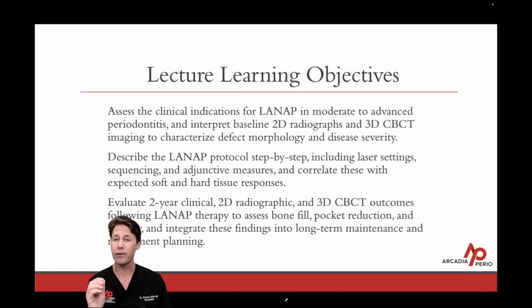And finally, this is a case that's been followed up for 2 years. This patient recently came in March of 2026 for a 2-year follow-up with periapical imaging and CBCT imaging. A really well-documented case that shows the power of regeneration with a laser-generated blood clot. I want you to be able to assess outcomes. So when you're looking at these x-rays, you know how to explain to the patient, look at what happened. Look at how much bone was regenerated in between the tooth roots. All incredible stuff.